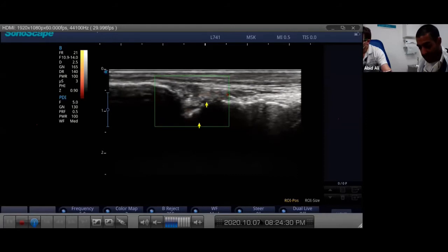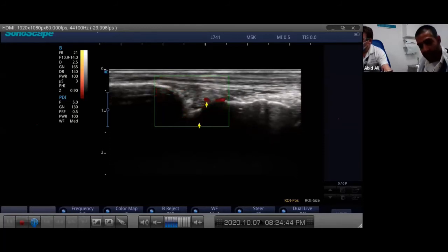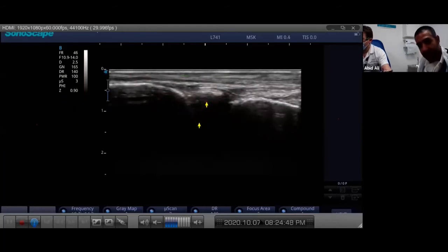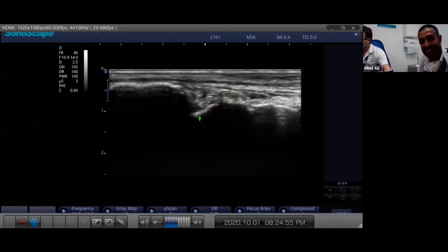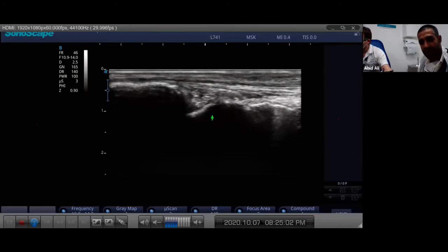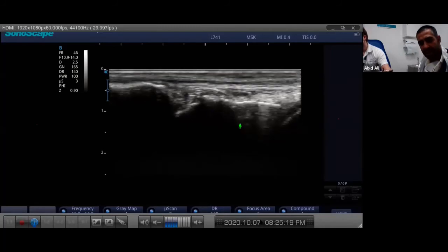We'd want to put color flow on here and interrogate to see if we can pick up any activity. When you're looking over the dorsum of the foot with color flow or power Doppler, you've got to be careful you're not picking up the deep peroneal artery or vein - you can get false information if you're not careful. Sometimes you might need to flick your probe into transverse axis to make sure. This is the kind of stuff you'd see in early arthritis - you'd probably want to get an X-ray to correlate and get more information.